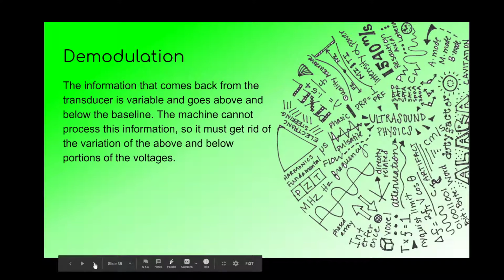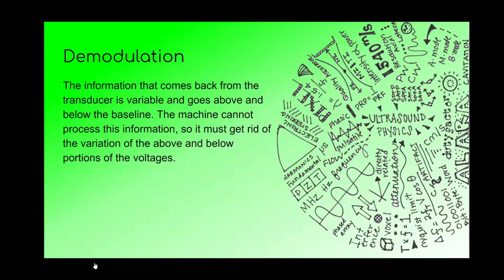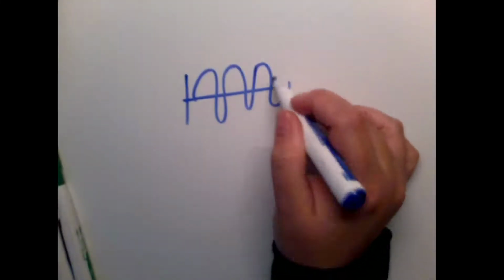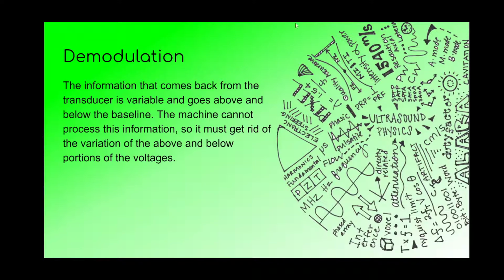The fourth step the receiver goes through is demodulation, and this is the first one that you cannot change. Demodulation occurs automatically in the receiver. When the machine gets those echoes back from the transducer, the echoes that are returning have portions above and below the baseline. If you think back to all the pictures we've been drawing showing echoes or how pulses go out, we typically draw something along these lines, right? We have above and below the baseline. Well, the machine doesn't know what to do with the below part. It can't figure it out. So that's where demodulation comes in.